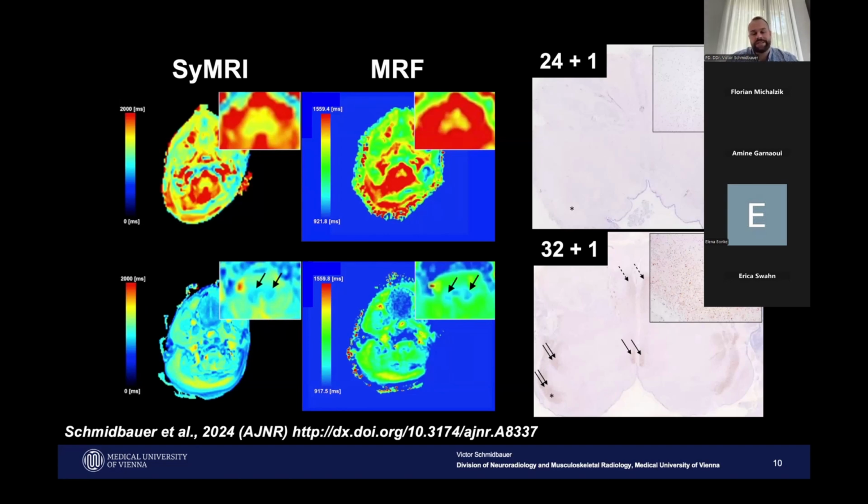However, if there is the case of a medically indicated and induced abortion, we also aim to image these fetuses that received ante-mortem or in vivo MRI. We also aim to image them post-mortem. And in these cases, it's also possible sometimes to get histological correlations for our MR studies. And this is what is presented on this slide.